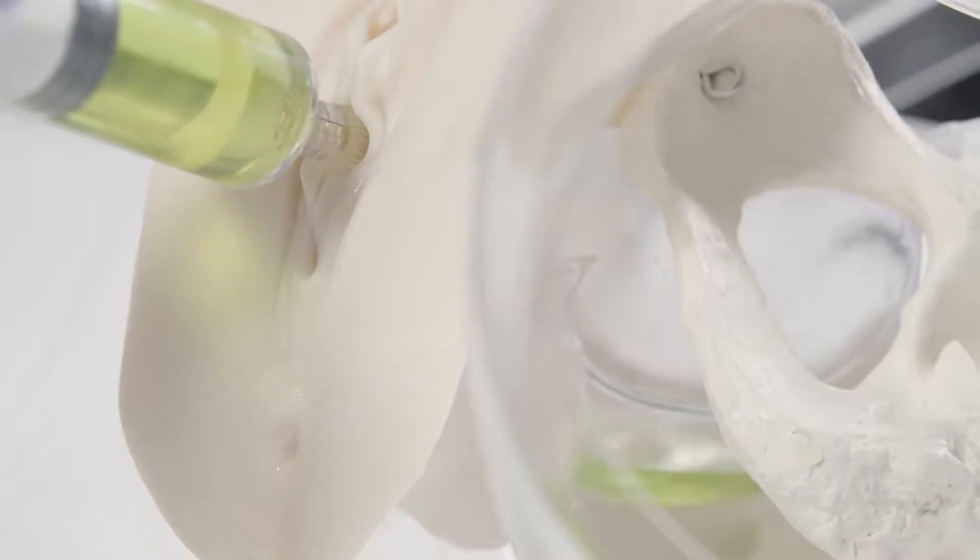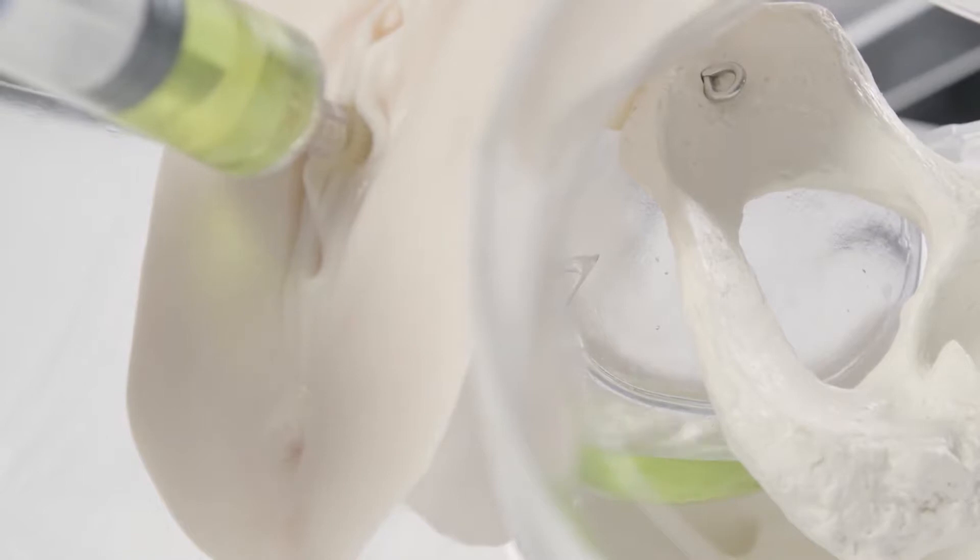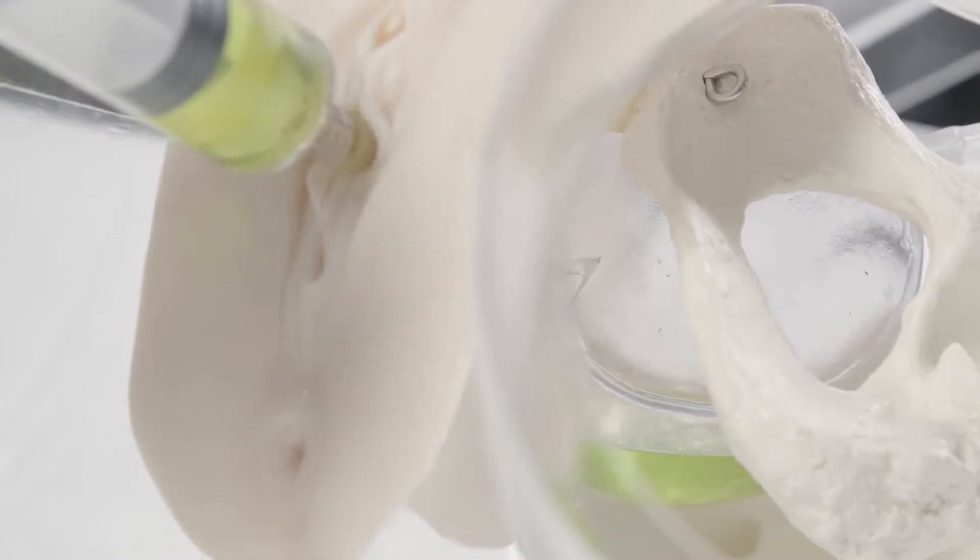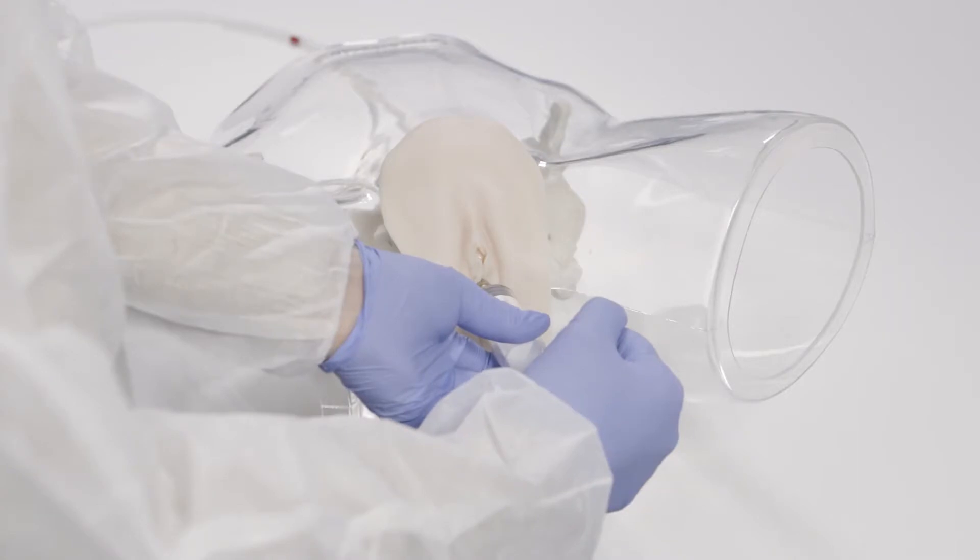It is important to align the yellow adapter to the orifice to enable a direct flow into the urethral orifice, straight and without resistance.